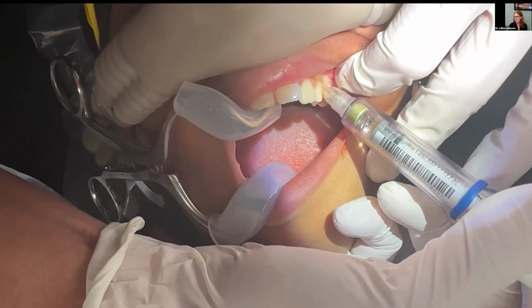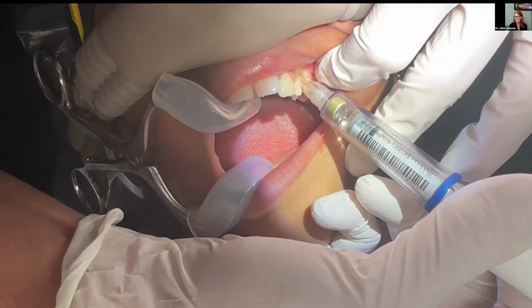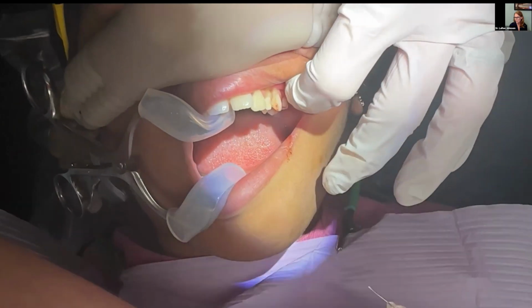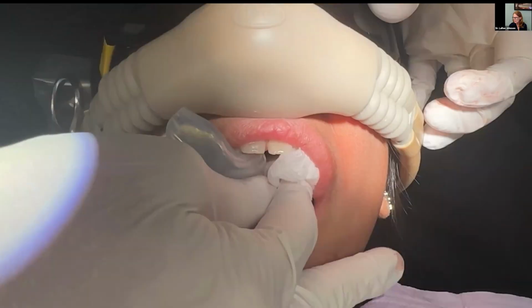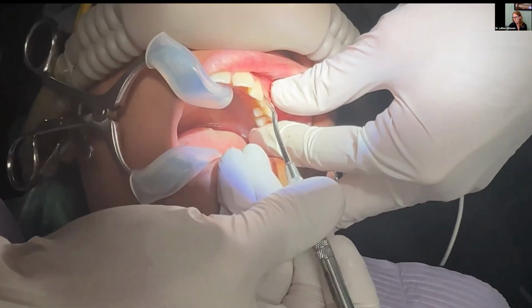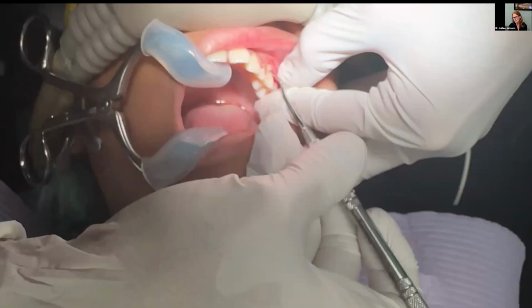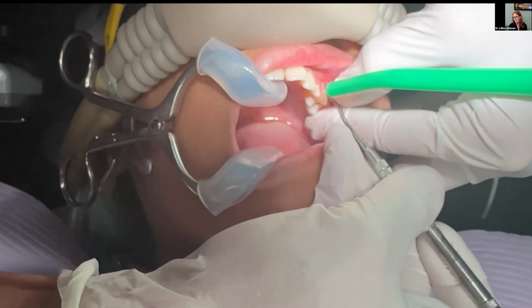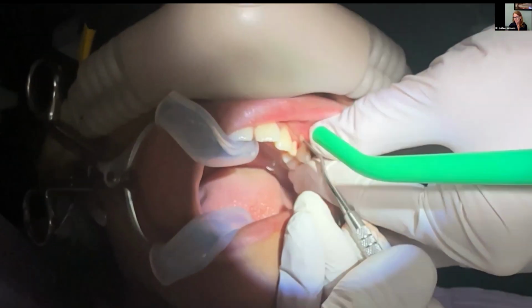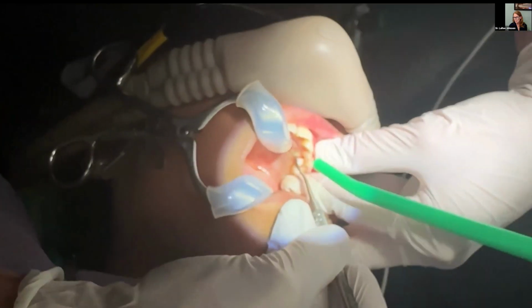I want everyone to see, as I finished in this carpule, what's actually left in this carpule. It's going to retract in just a minute, and it's retracting now or I wouldn't have come out. So that's a little less than 1/8 of a carpule. I saw the blanching. I don't test anything. I pick up, I'm taking out that primary canine and that premolar, and I go immediately to the soft tissue release. Don't think twice about it.